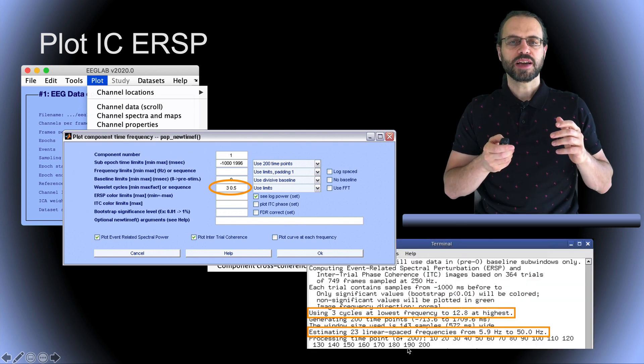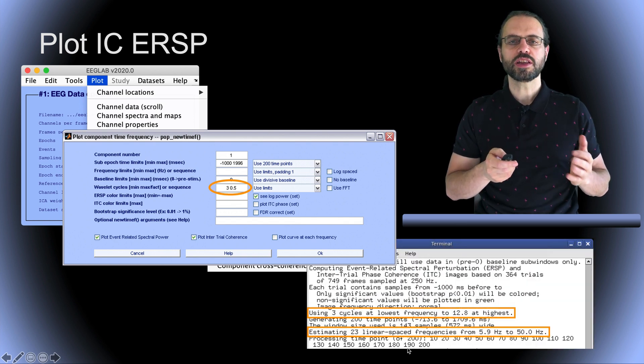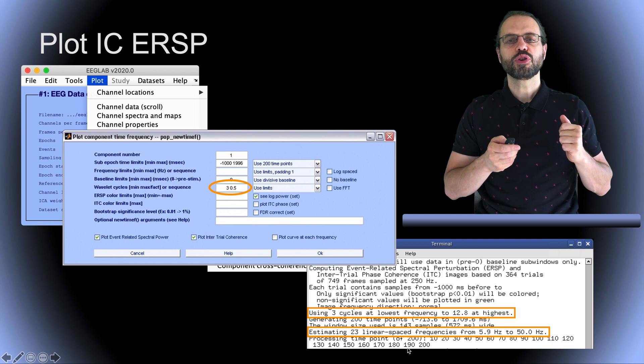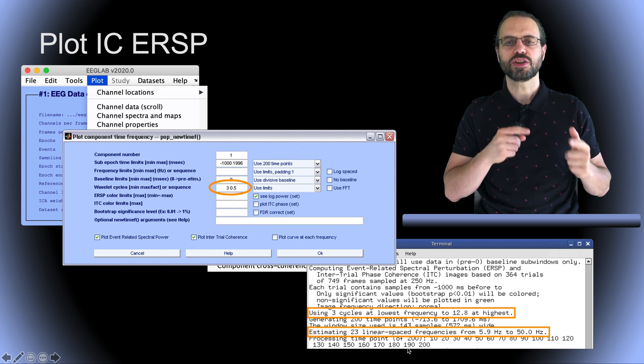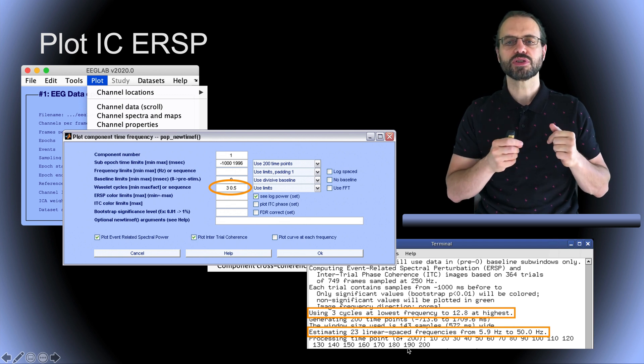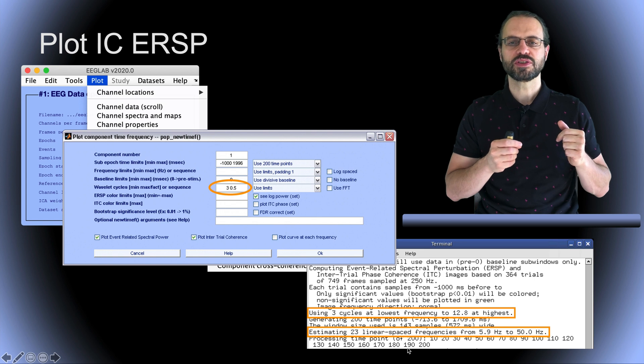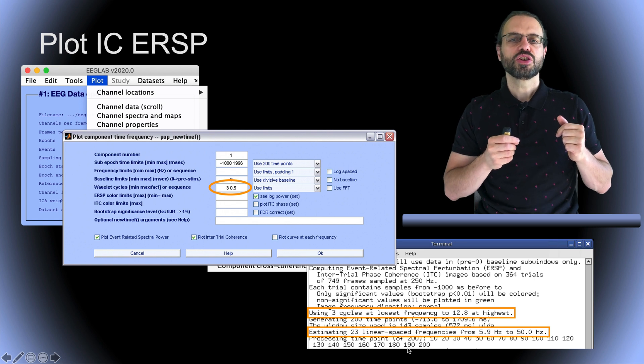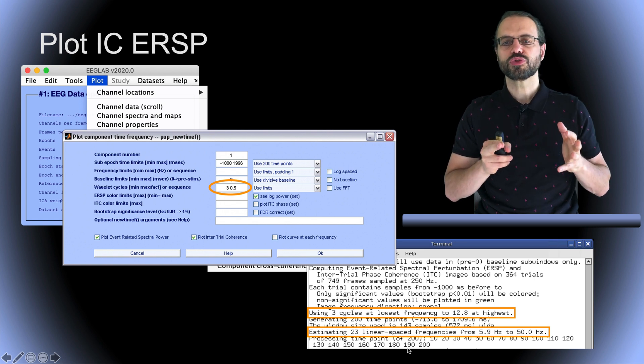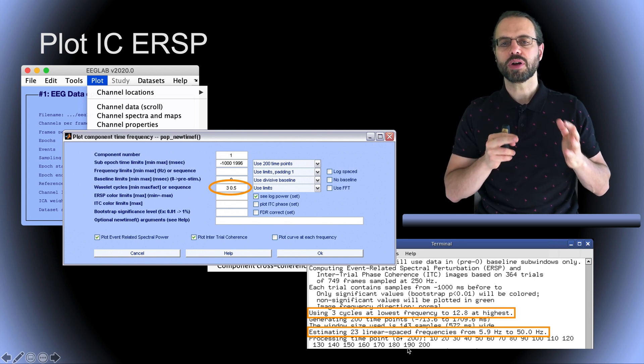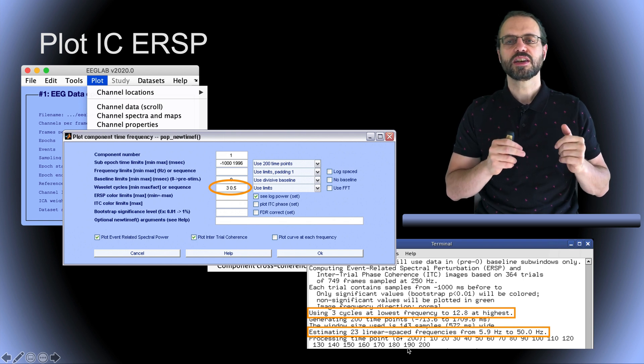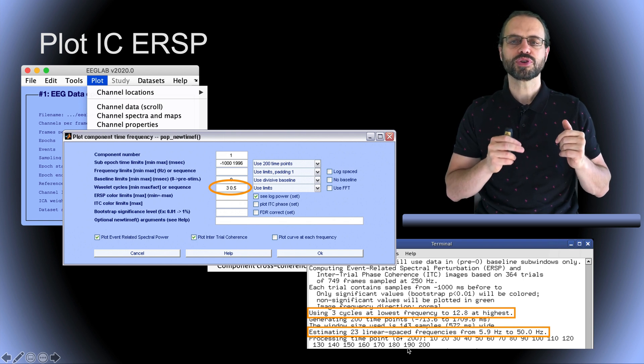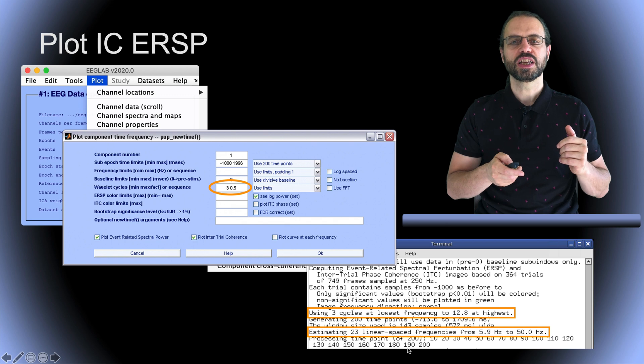Here we have selected to plot component 1. If you look on the MATLAB command line, you can get more information about the number of cycles at the lowest and highest frequencies. You can also get information about which frequencies are being processed, in this case 23 frequencies from 5.9 Hz to 50 Hz.